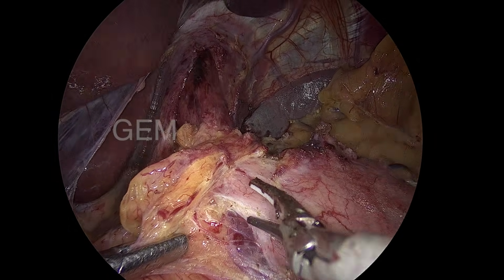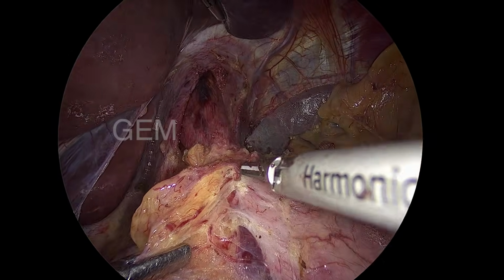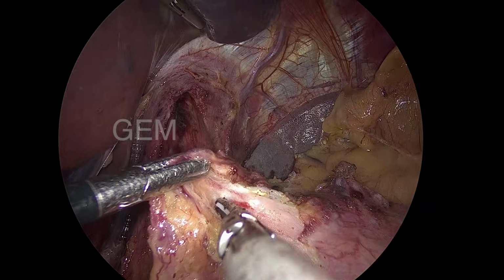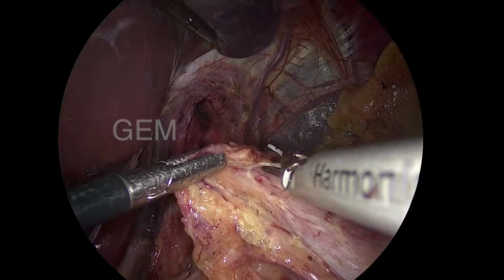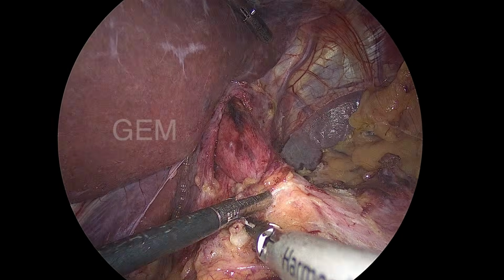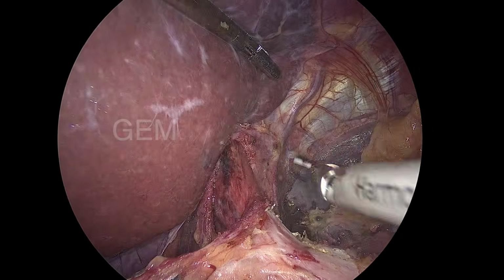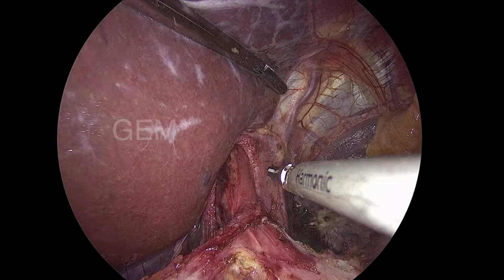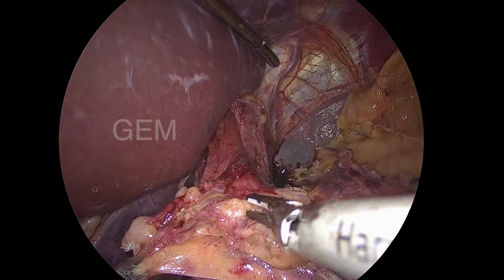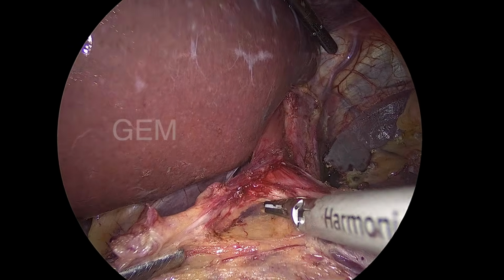So that is the lesser curvature. Here the vagus branch to the lesser curvature will be there, that can be divided, and you should not enter the esophagus. By doing this, you should not go deep and then enter the esophagus. So now I am on the esophagus. You can see that again the layer covering the esophagus is removed. You can see the longitudinal muscle of the esophagus, so that your myotomy will be easier.